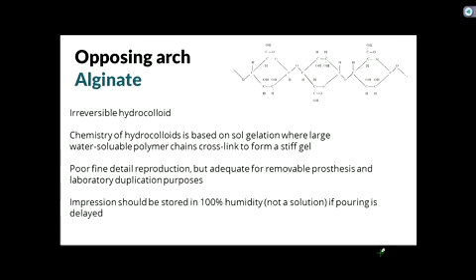So if you don't pour it up right away, you should store it in 100% humidity. Don't just dunk it in water. What we'll teach you is to wrap that in a wet paper towel, put that in a Ziploc bag, and that'll buy you some time so it prevents distortion.